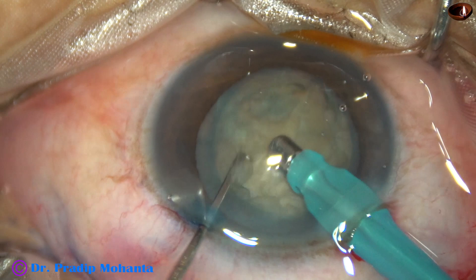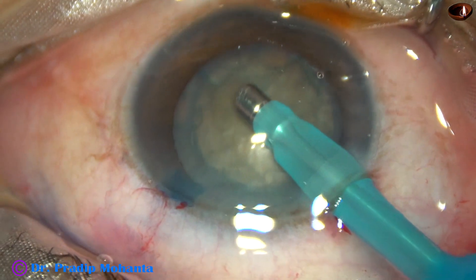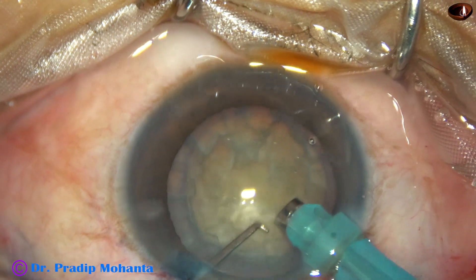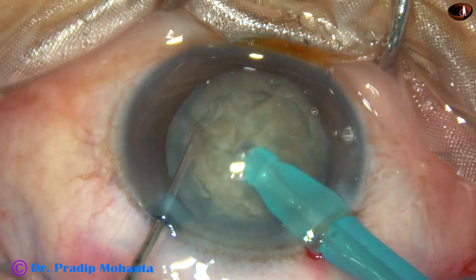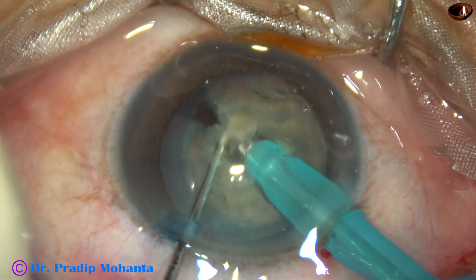After aspirating some superficial cortical lens matter, the handpiece is turned — bevel up towards the cornea. The nucleus is pushed a little down, the tip is buried into the substance of the nucleus, and it goes through the nucleus towards the opposite equator like a submarine. Then it is chopped.